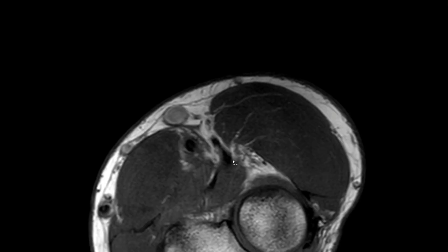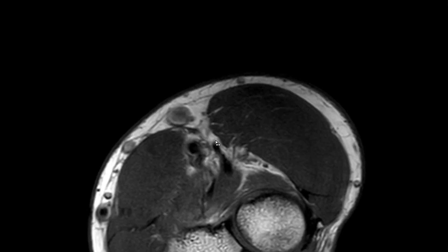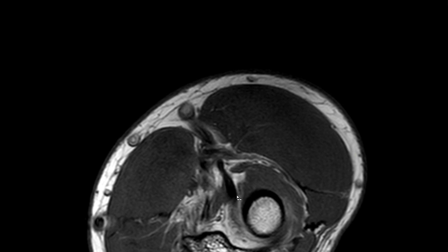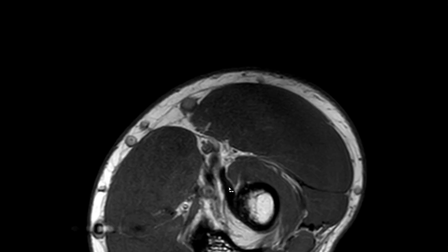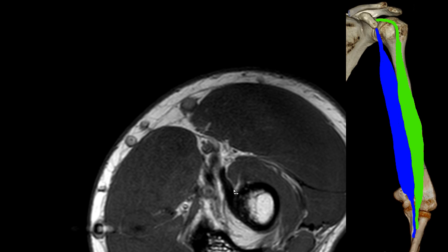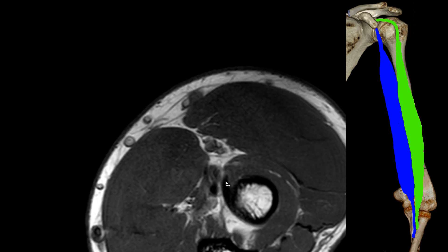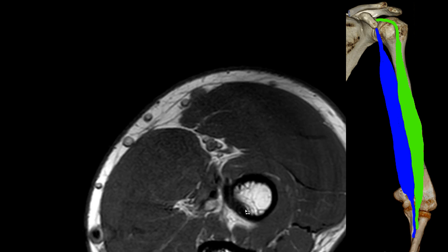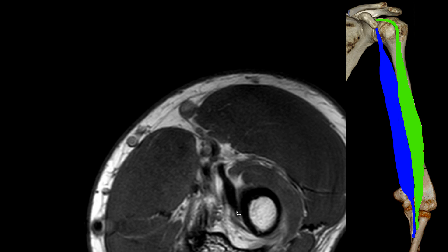Continuing distally, we can follow both tendons here. One tendon and the other. You can see that this one is inserting here — this is the proximal insertion of the distal biceps tendon, which corresponds to the long head. And this is the tendon of the short head, inserting far more distally, but still on the radial tuberosity. So we have the proximal insertion here for the long head and the distal insertion for the short head.